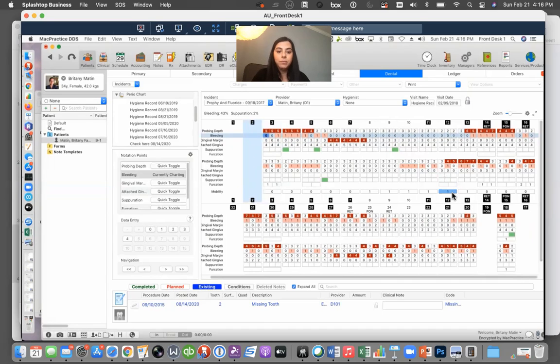The next thing we are going to measure is the gingival margin. A gingival margin is the actual recession. So sometimes we have patients who have gum disease and we're measuring their gum disease, like periodontal disease or pyorrhea, just traditional perio disease. We use the periodontal pocket for that, or the probing depth. Sometimes our patients are referred for recession. Recession is denoted by gingival margin. So when you are looking at this periodontal chart, gingival margin is the actual recession that exists on a tooth.